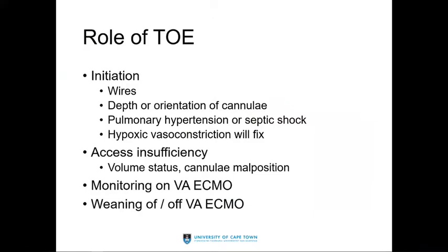In terms of TOE, just for the anaesthetists, we do use TOE a lot, and it's important in the setup not to get distracted by the TOE focus, because there's a very sick patient, and I always try and task someone to actually focus purely on keeping the patient alive during the ECMO initiation process, and deliberately not look at the TOE discussions that are going on. We would use TOE to confirm wire placement, the depth of the cannula, and in an Avalon cannula, which is like a big vas cath that you put through the IJ, with a return and a drainage limb, the orientation of that cannula is important.